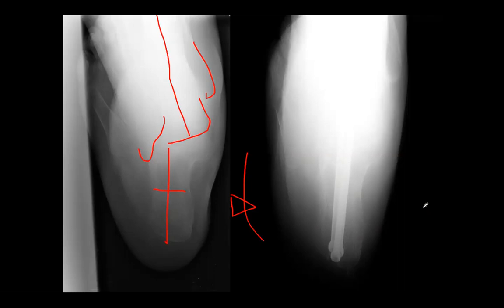Clarity. All right, what do we think? We kind of have the answer to this one because there's a post-op image on the right, but when you bisect the talus and you bisect the calcaneus and they don't align that way, we don't have an intrinsic calcaneal deformity. We have a deformity at what joint is this? Good, we got a lot of STJ people, good.